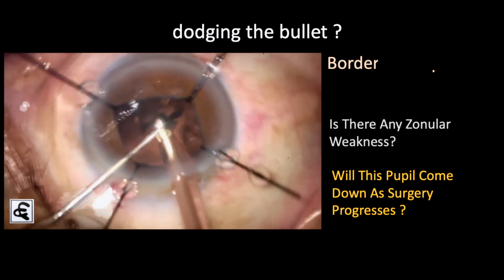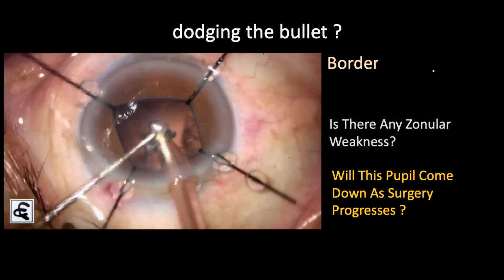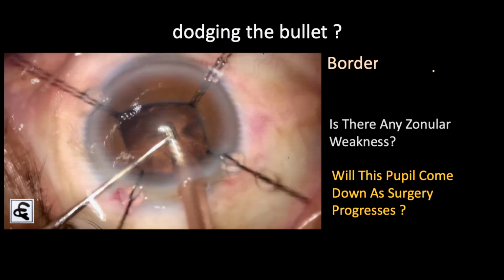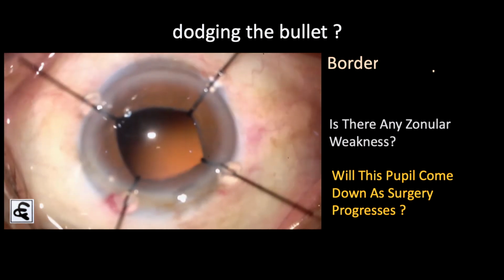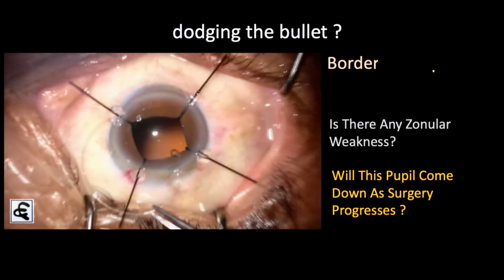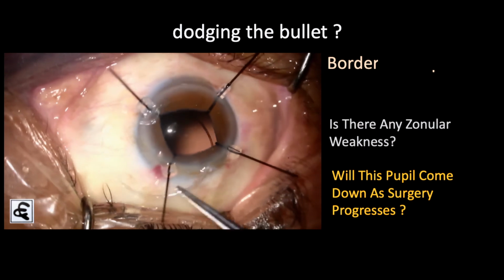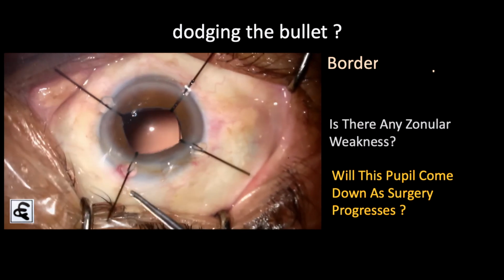And once you complete it, then there's this other step at which you can have a little problem, because if the zonular support is not good enough, you should be careful during the IA also. And you go ahead and implant the lens. You could see there was some difficulty. You put in a CTR first. Now, what does the CTR at this stage do?